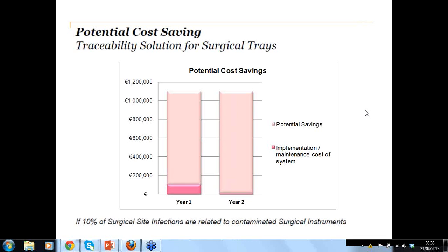I don't know if there's a specific recommendation for this, but how it's done, as I know it, is the instruments are used in the operating theatre. They're then left outside the operating theatre, and a porter brings these to the washroom. So they're not actually washed until they get to the CSSD. However, the decontamination unit should be divided into two, so you should have the washroom separately cordoned off from the sterilization area. They'd be hand washed in the basins and then brought to a separate room for sterilization in the clean room.